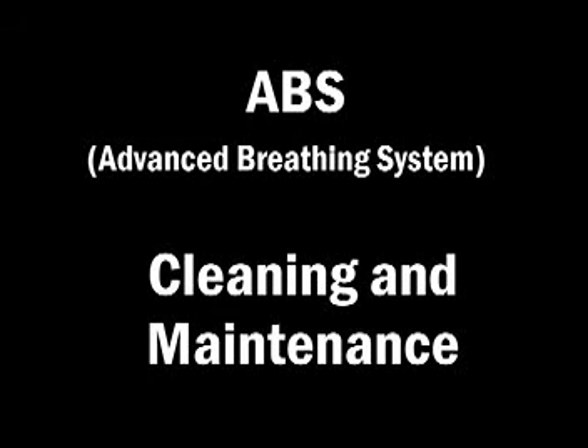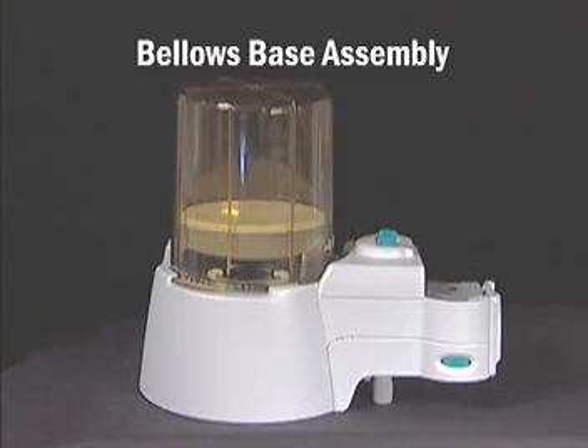Cleaning and maintenance of the ABS is simple and requires no tools. The following parts are autoclavable assemblies.